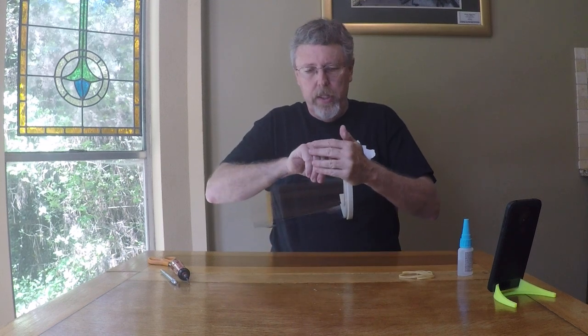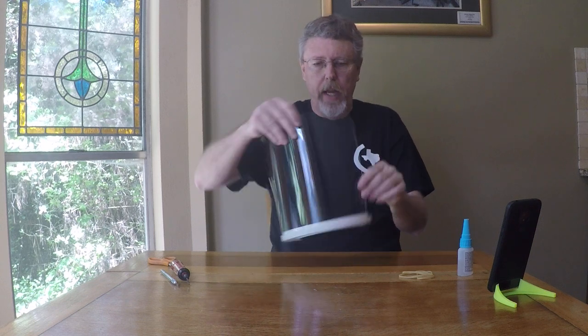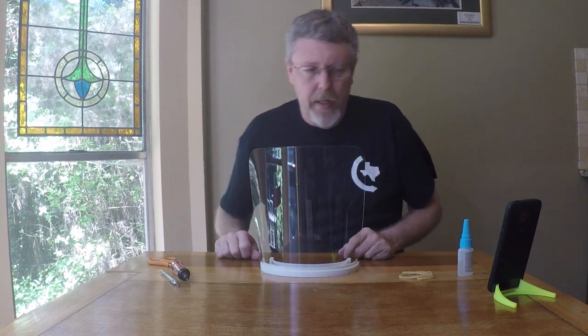I'm just going to make sure it's all the way in. And that's it — in 30 seconds this will be ready to use.